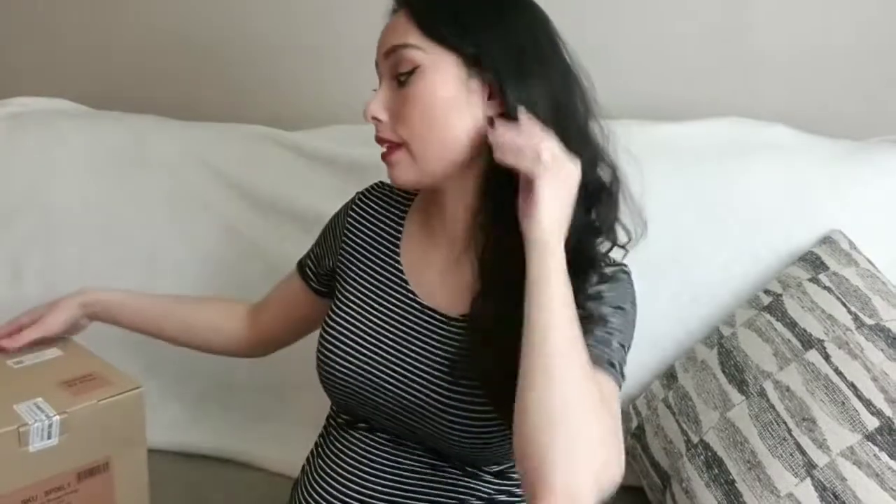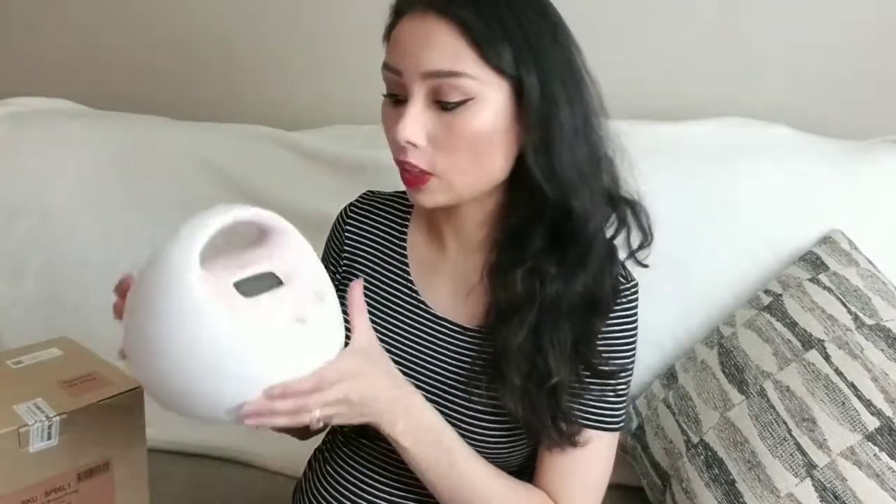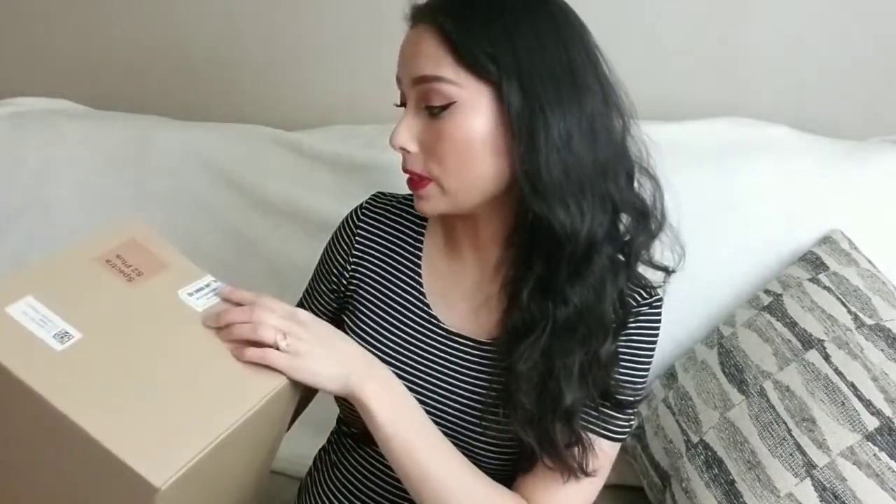I took everything out because I didn't want to be back and forth reaching into the big box. The pump I went with is the Spectra S2 Plus — so cute. After a lot of research, this is the one I wanted to try. It is electric. Inside the box there's one pump, two collection kits, an AC adapter, and the instruction manual. It actually says, 'Our pumps don't suck, they suckle' — that is so cute!